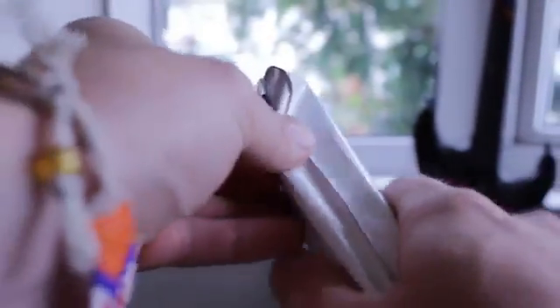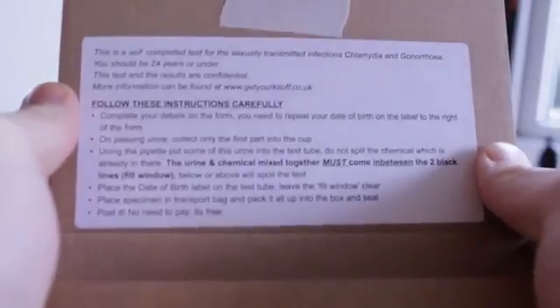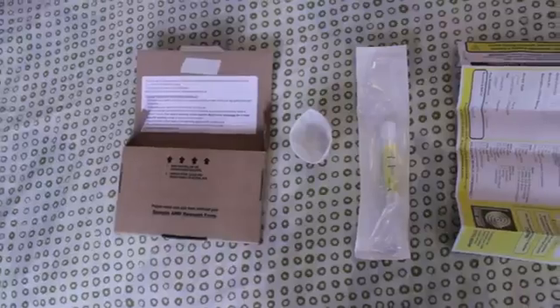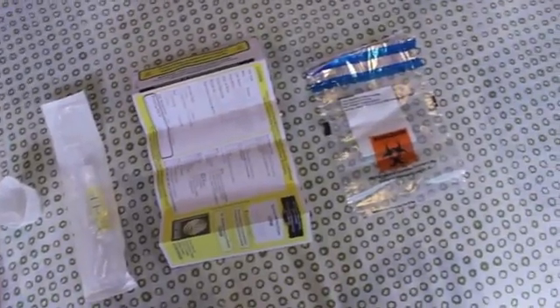Once you've taken the plastic off, you'll find this box. And this is what a test kit looks like. When you open the box, it will tell you how to do the test step by step. This is everything that will come in your test kit — it will give you all the bits of equipment you need to do the test.